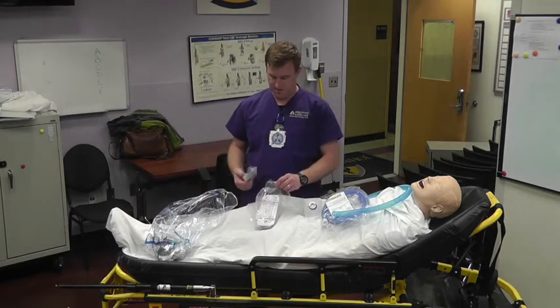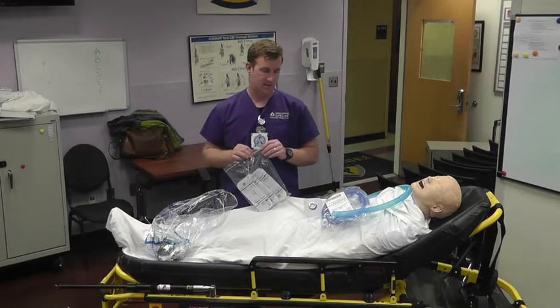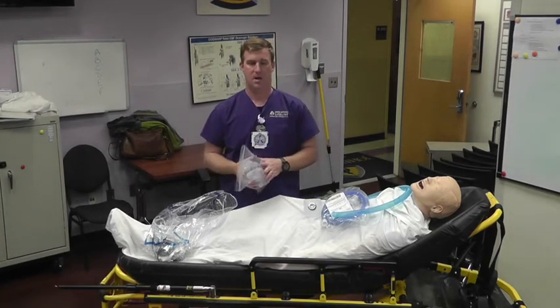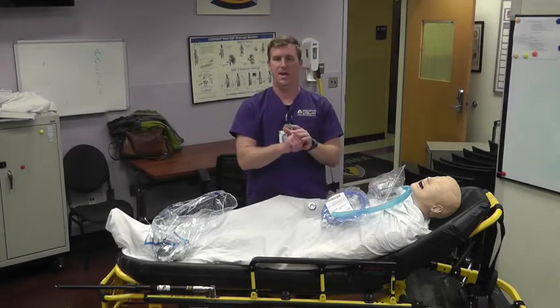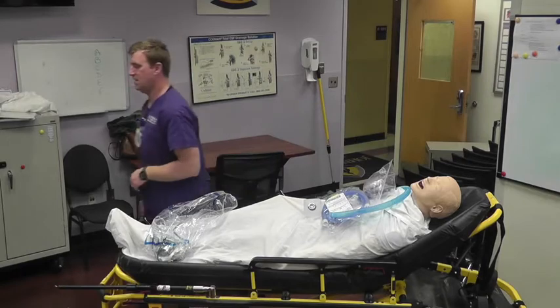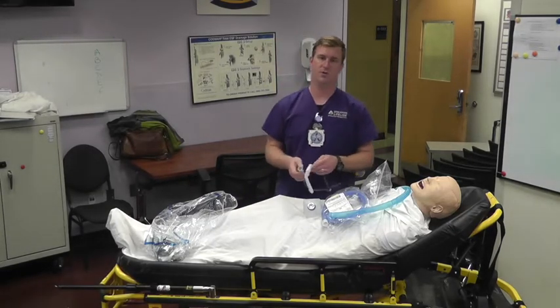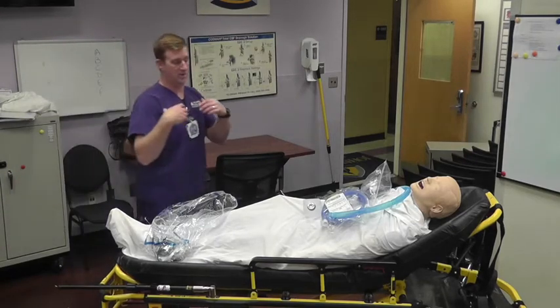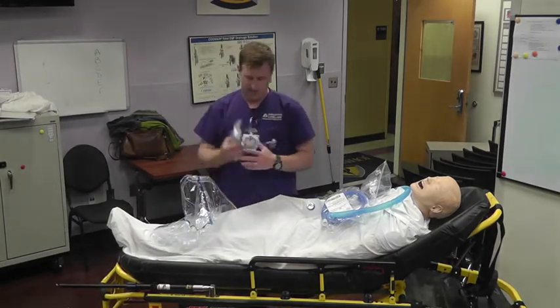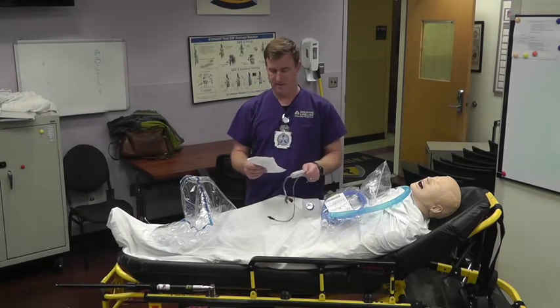You'll have a set of cannulas — small, medium, and large — and the vast majority of patients are going to end up with a medium. A lot of the hospitals we pick up from use these exact same cannulas, so you may be able to just take the cannula from the bedside. You just want to look at the connection — if it looks like the end of an ET tube or vent tubing and it'll fit on your stuff, just take their cannula and connect it up. The last two things in this bag are a yellow cable with a yellow end and a blue cable with a blue end, which we'll cover when we get the heater running.